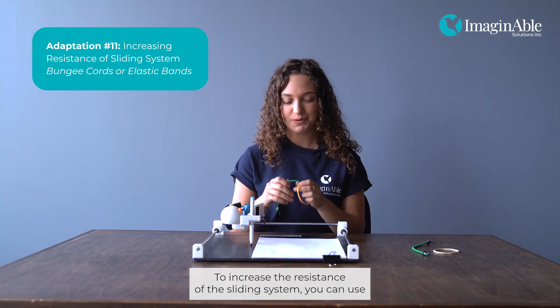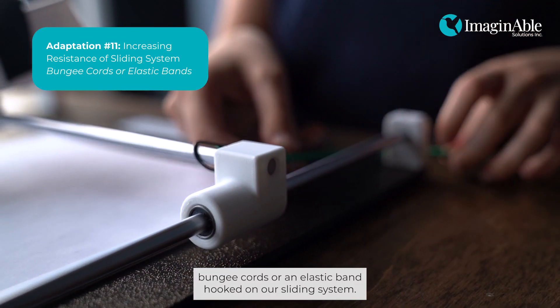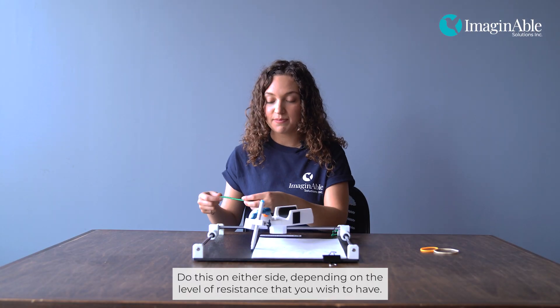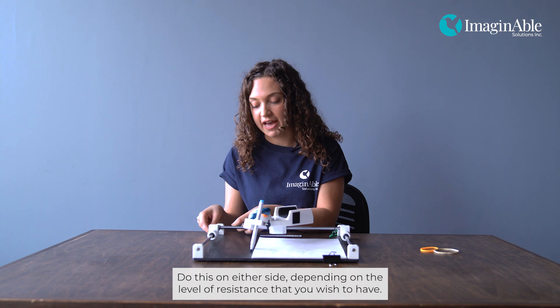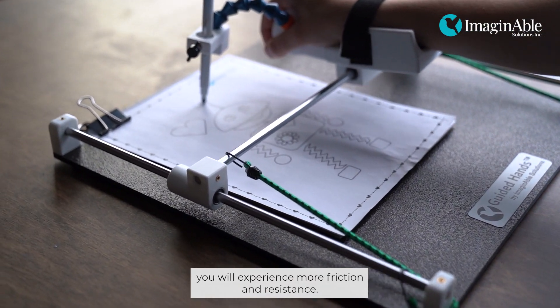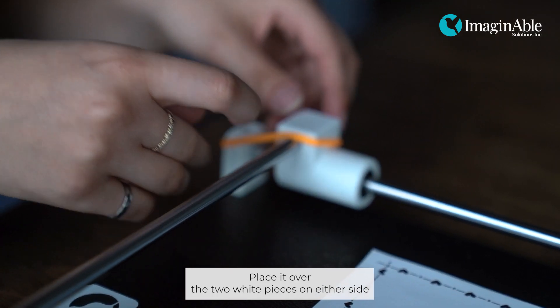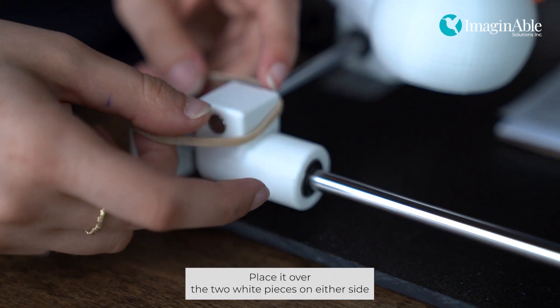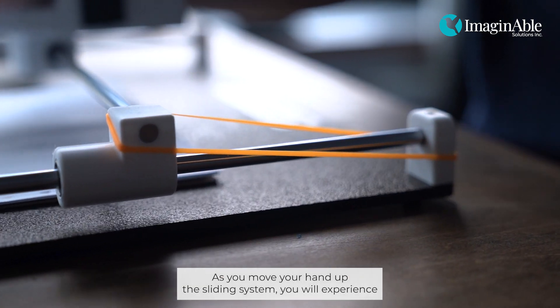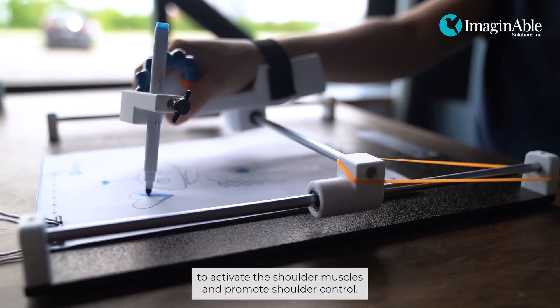To increase the resistance of the sliding system, you can use bungee cords or elastic bands hooked on the sliding system. For the bungee cord, hook it around the rods and the stand on either side, depending on the level of resistance you wish to have. As you slide up on the sliding system, you will experience more friction and resistance. Similarly, you can do this with elastic bands — place them over the two white pieces on either side. As you move your hand up the sliding system, you will experience more friction and resistance, which is a great way to activate the shoulder muscles and promote shoulder control.